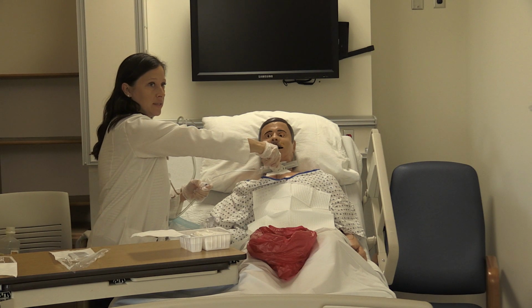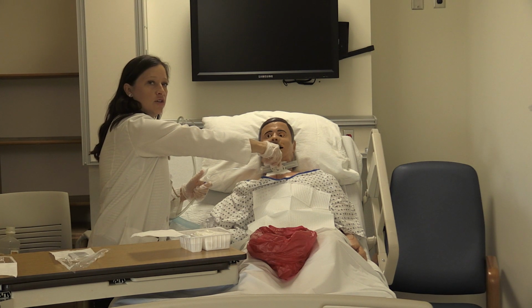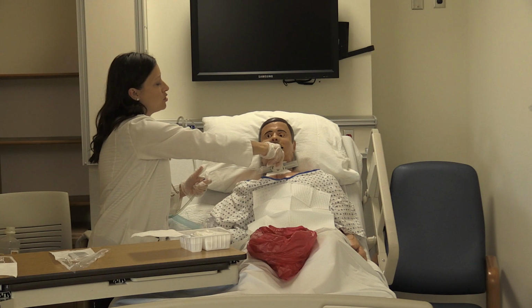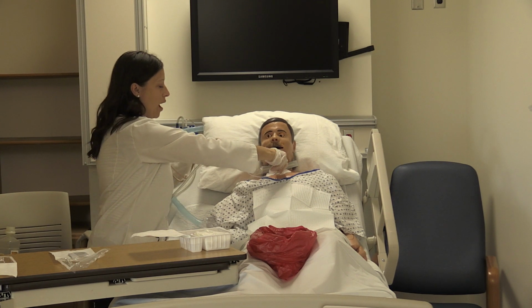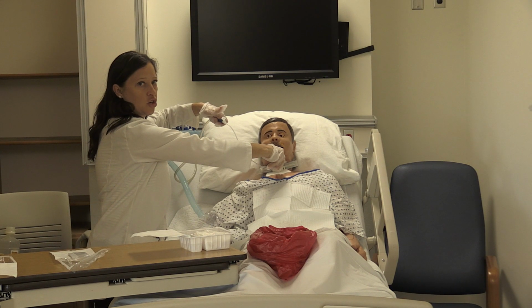When you feel the resistance, it's at that point you'll start to withdraw the catheter. So you want to withdraw the catheter in a twisty motion while you are intermittently suctioning.